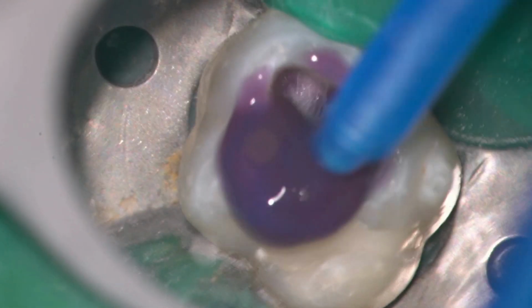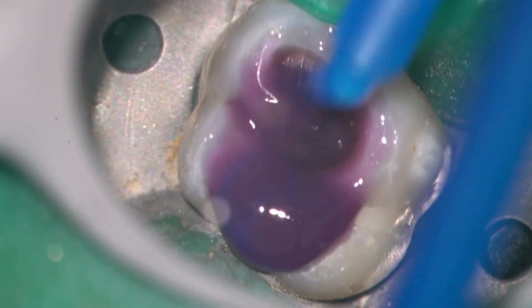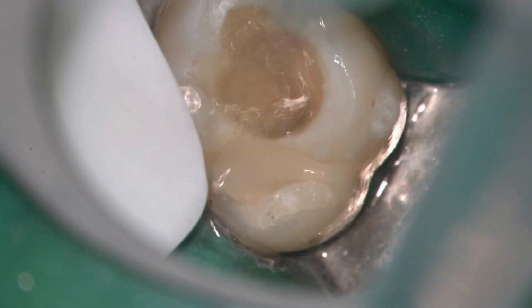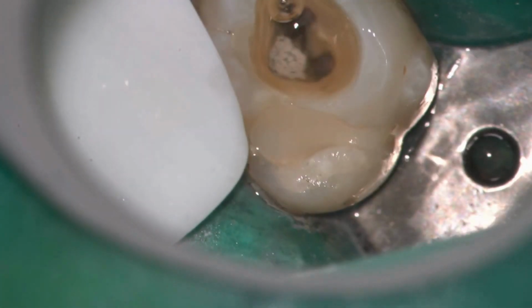At this point, I temporarily take the shield off for visibility, place the phosphoric acid, scrub it in the pulp chamber, and then rinse it with water thoroughly.